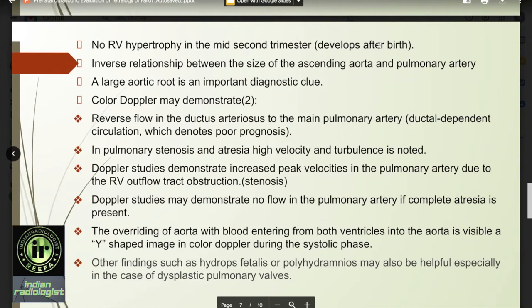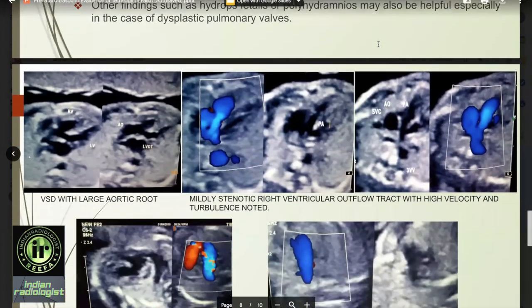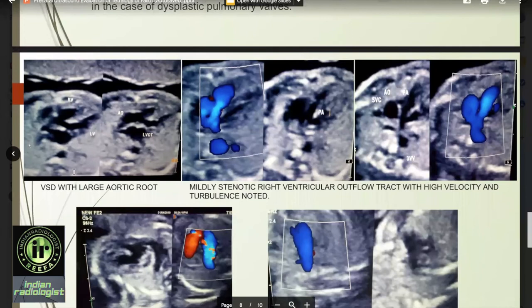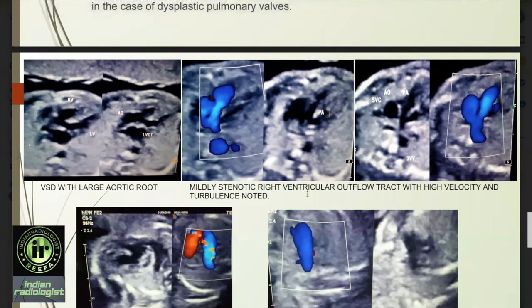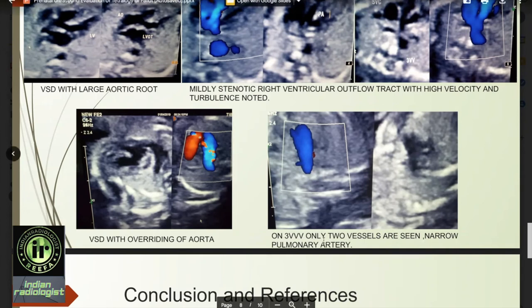Other findings such as hydrops fetalis or polyhydramnios may also be helpful, especially in the case of dysplastic pulmonary valves. In the first image, there is a VSD with a large aortic root. In the second and third images, there is a mildly stenotic right ventricular outflow tract with high velocity and turbulence noted. In the fourth image, there is a VSD with overriding of the aorta. In the fifth image, in the three-vessel view, only two vessels are seen and a narrow pulmonary artery is noted.